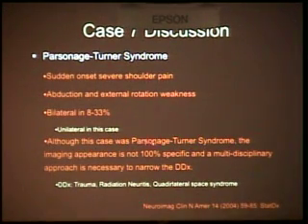This diagnosis is not specific. There are lots of things that can look like that, but based on the clinical history and how the patient did after receiving treatment, they ended up thinking it was Parsonage-Turner. But for all intents and purposes, trauma, radiation changes, and quadrilateral space syndrome could all look similar. So this would be more of a differential diagnosis case, but based on the follow-up, it turned out that this one was Parsonage-Turner.